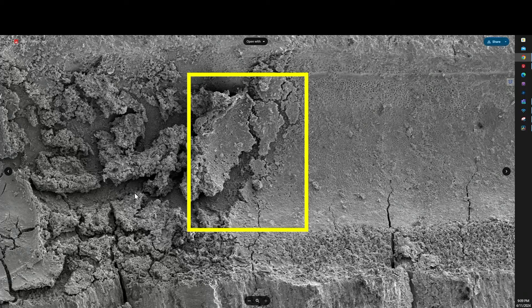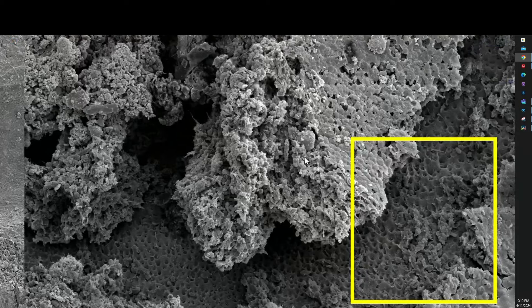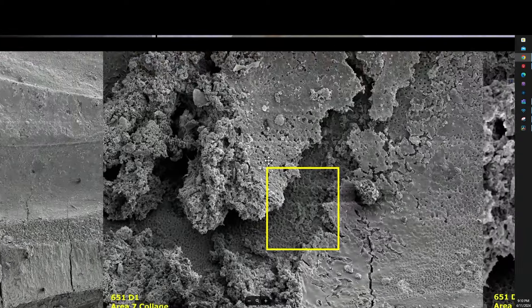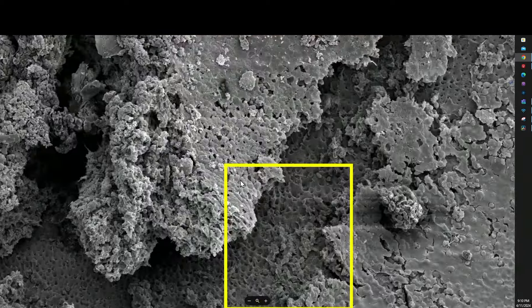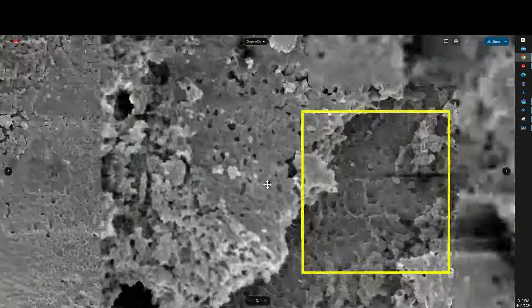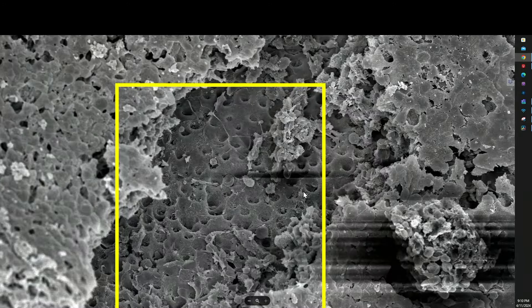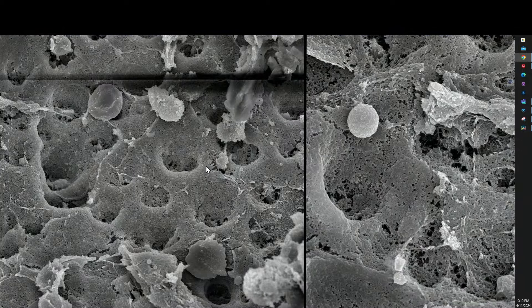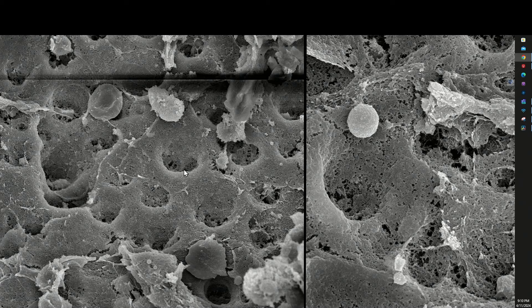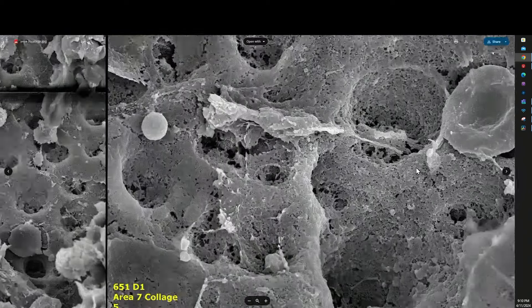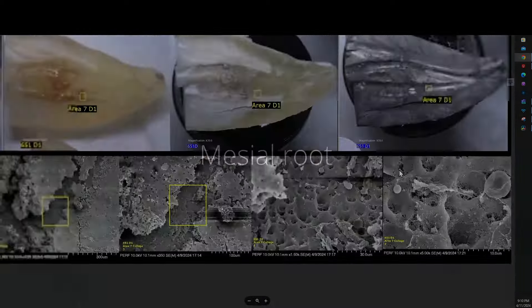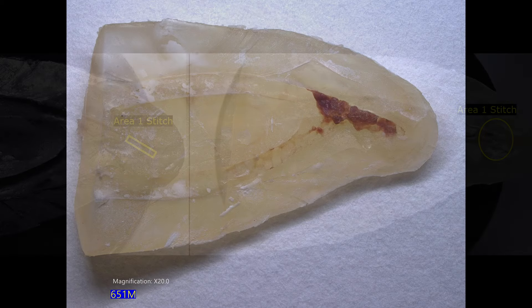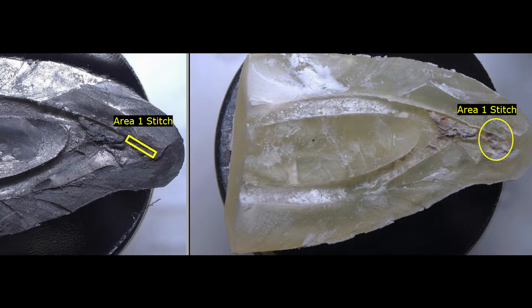And here you see it's kind of caked on right above the mineralized surface. And even below that area you can see there's been considerable demineralization of the mineralized front. And again, occasionally you'll see what looks to be like some actinobacteria. But you have to look really hard to see any evidence of any bacteria morphotypes at all.